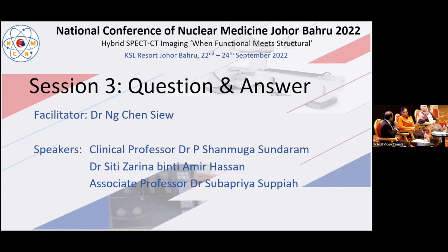So it should not affect too much, but it affects in lymphomas where the follow-up scan can be non-contrast, but that's where the semi-quantitative parameters, Deauville score, comes into play. So where you don't compare it with the previous scan, rather you are comparing it with the same study's mediastinum as a background, liver as a second background. So obviously this correct utility of these quantitative parameters will help, and we need to keep it in our mind when we are reporting how significant is the SUV reduction.